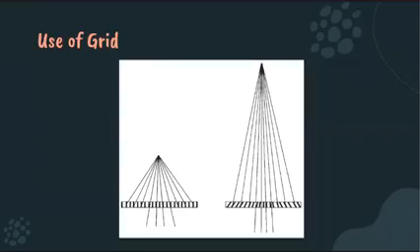Anytime improper distances are used or when the X-ray beam is not properly aligned with the grid, primary beam X-rays strike the lead grid strips broadside or at an oblique angle rather than passing through the grid parallel to these strips. Ganito kasi yan. When we use a grid, the divergence of the X-ray beam should be aligned to the interspaces between the lead strips. Okay, this allows proper passing of the primary beam through the grid, therefore reducing the incidence of grid cutoff.